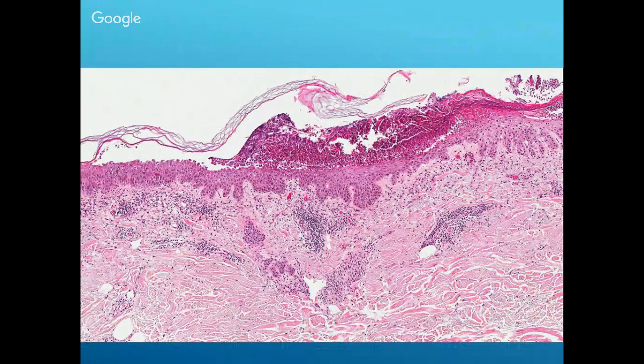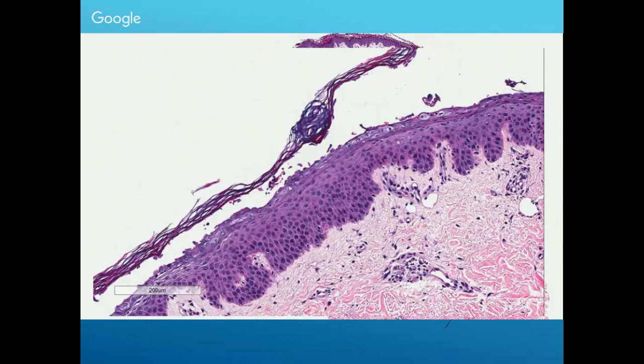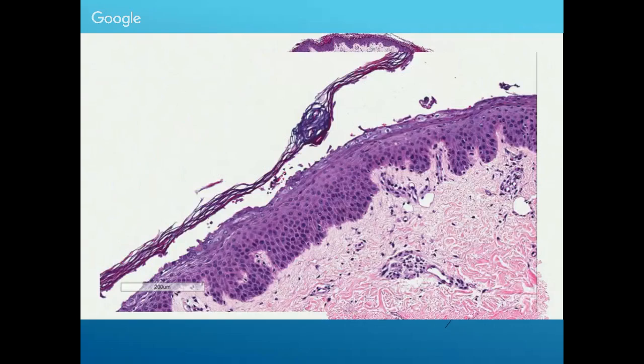If it is a bullous impetigo, you're going to again see the split, but now you're going to see associated neutrophils within the split. So if you see associated neutrophils within the split with the acantholytic cells, you're going to think, am I dealing with bullous impetigo? And this was again, this is pemphigus. So yeah, let's go back. So sorry, this is all mixed up.